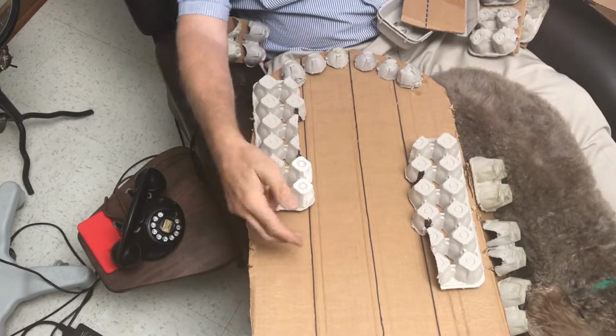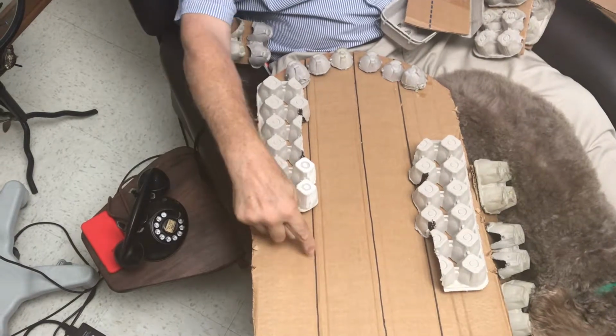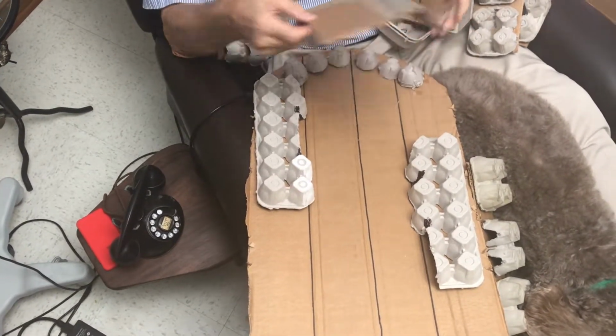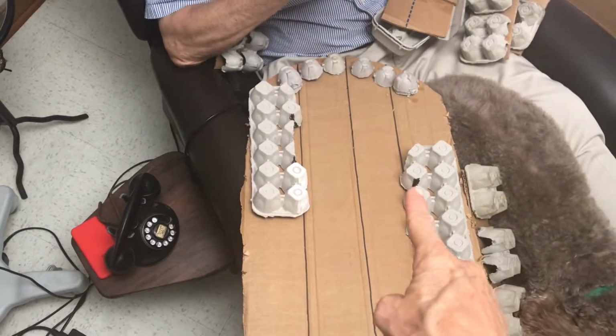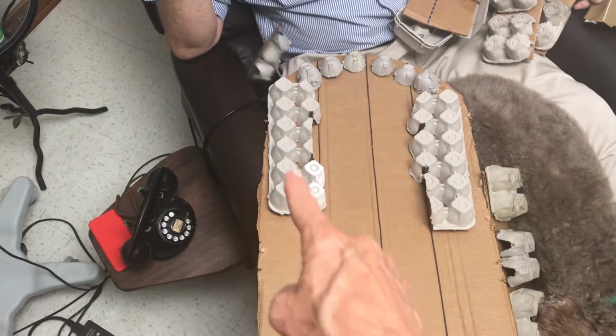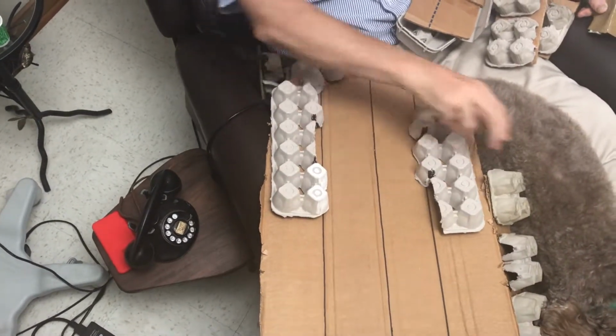If there's a third molar, we tend to leave it out and let the tongue come in this way, right here. Seldom do we work with the third molar. These here are a simulation of what the appliance would look like. The sides of the appliance.